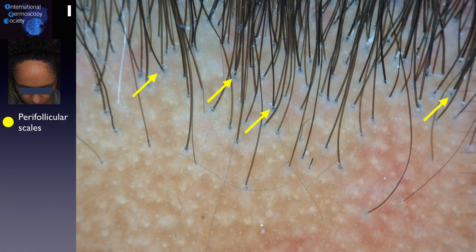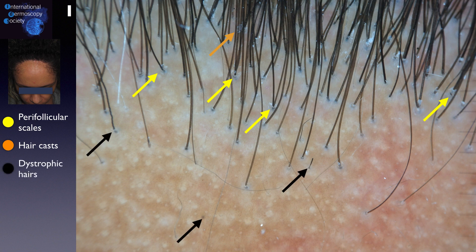In addition, tricoscopy shows perifollicular scales and some areas revealing hair casts around the shaft. These dark areas point to dystrophic hairs. The first finding represents moderate inflammation. As the inflammation gets worse, we can find broken hairs and black dots — that's why these are good biopsy sites.